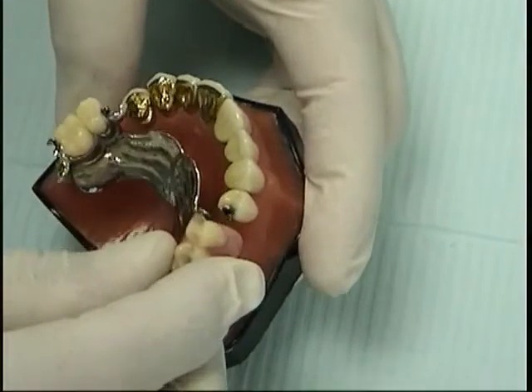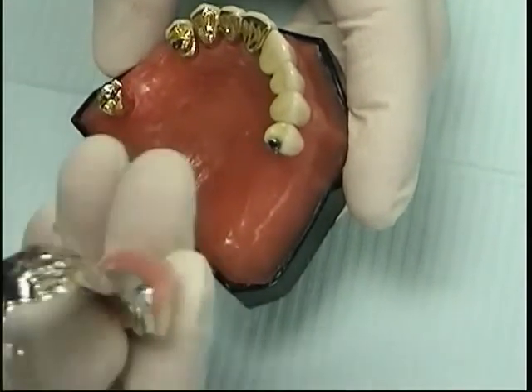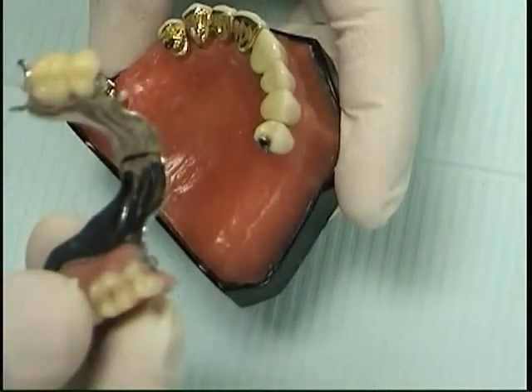Partial dentures are removed easily for cleaning. Two types of attachments are used in partial dentures: metal clasps and precision attachments.